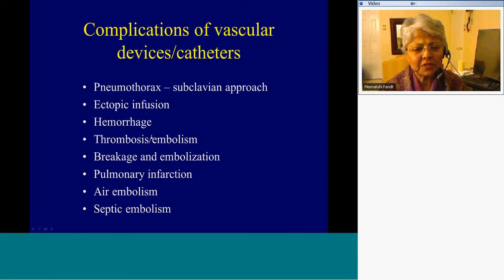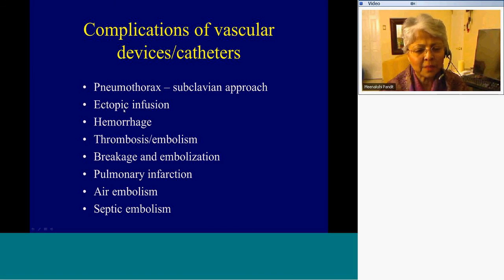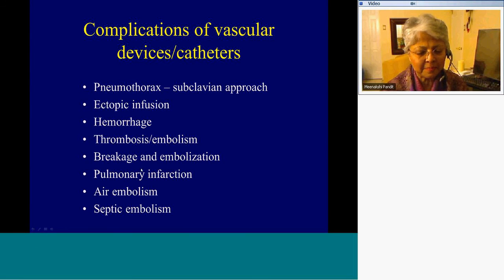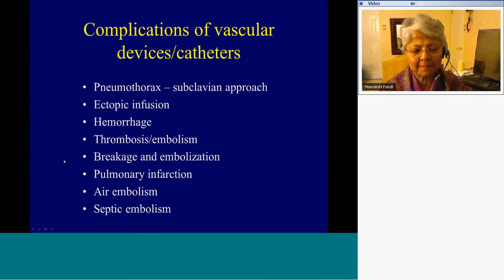Vascular device complications with a subclavian approach include pneumothorax, ectopic infusion, hemorrhage, thrombosis and embolism, leakage and embolization of the catheter, pulmonary infarction, air embolism, and if the patient acquires infection, then septic embolism.